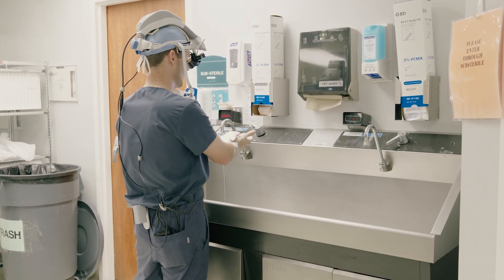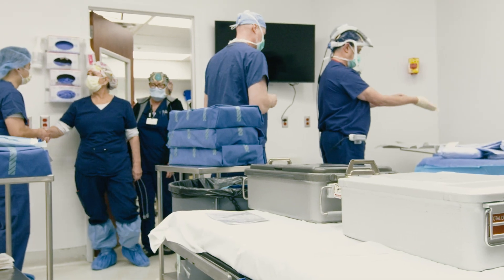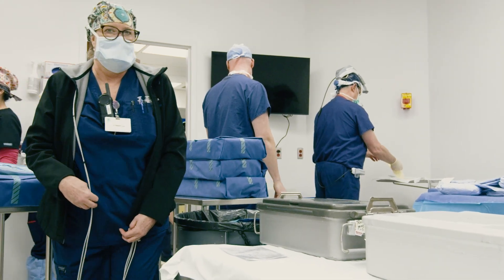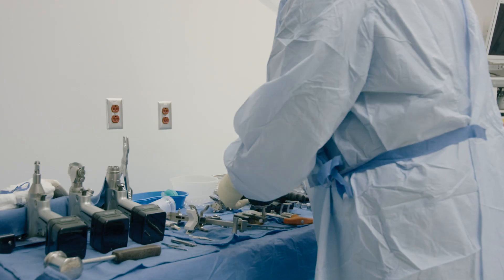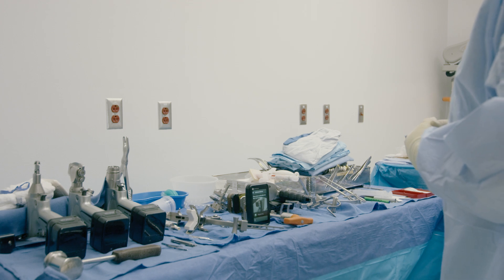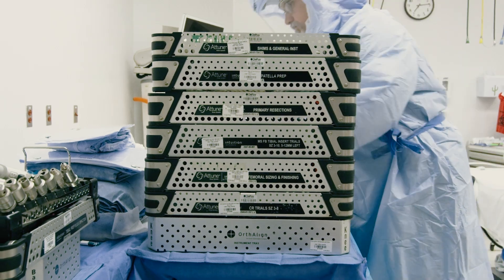From a staffing standpoint, we have multiple CRNAs as well as multiple first and second assistants. We're fortunate enough to have two joint dedicated rooms where we're able to flip back and forth with two separate teams. With the transition of a lot of primary hip and knee replacements being taken from the hospital to the surgery center, a lot of our technology comes with it. And with that, we need products such as OrthAlign so that we can use these tools in a surgery center setting and allow us to reproducibly and accurately place our knee replacements.